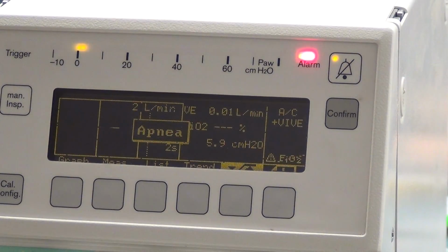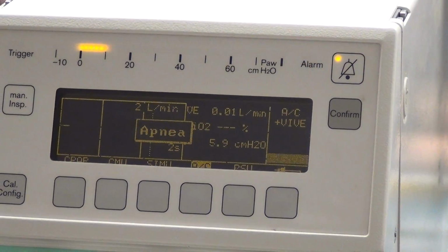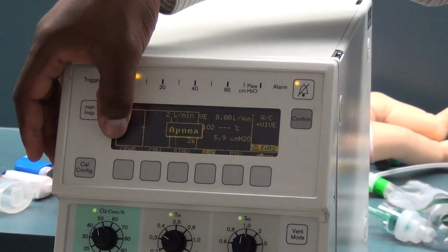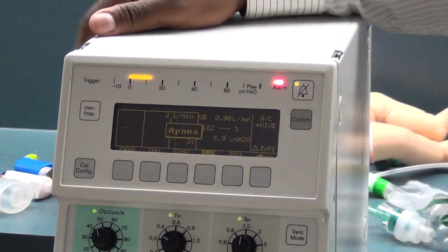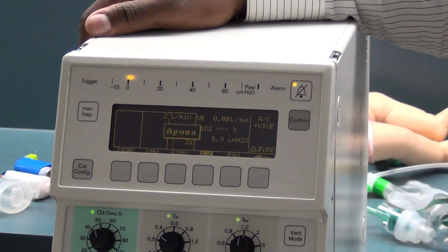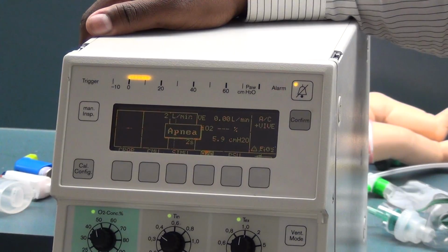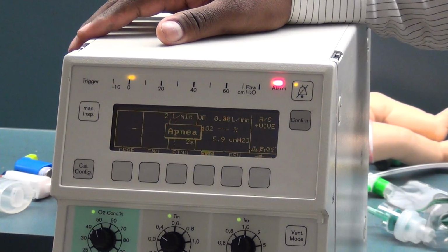Well, in order to do that, we have to figure out exactly what mode of ventilation we want to be in. So we press vent mode. And so once we press that button, we have CPAP, CMV, SIMV, AC, and then PSV. For demonstration purposes and also for your checkoff, we'll focus primarily on the CMV or the AC aspect of this ventilator. So right now we're in AC mode.